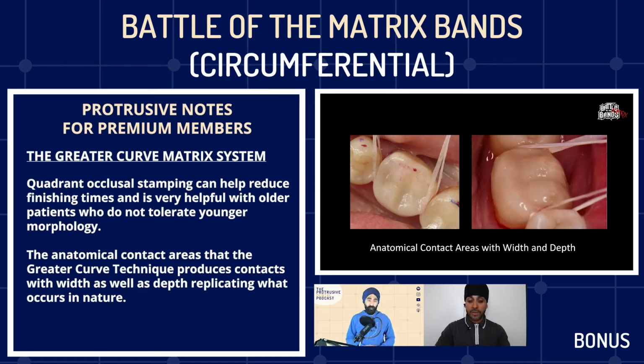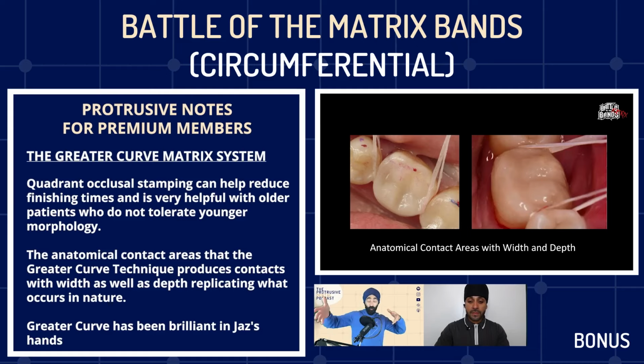Amazing. Sonny, you've given us a good overview of the different matrix systems. It showed us the greater curve, which was the trump card. And from my experience, I'd like to apply it to all these other scenarios as well. But certainly I've been doing it for the really large subgingival reconstructions. And again, that word, reconstructions. It's been brilliant in my hands for those reconstructions so far. I'm still on a bit of a learning curve. That's why I'm reaching out to you for mentorship and guidance. So it's great to have that. And thank you so much for doing that.